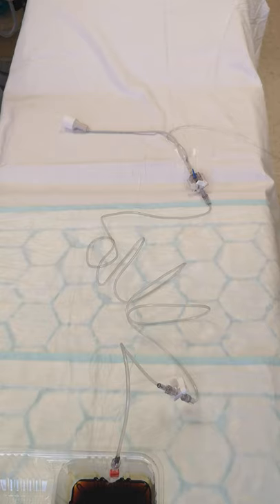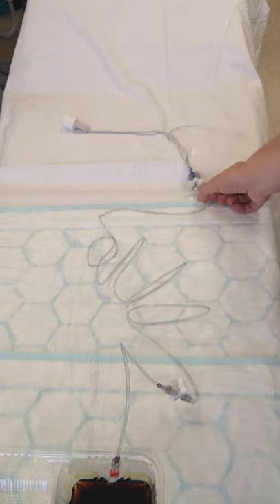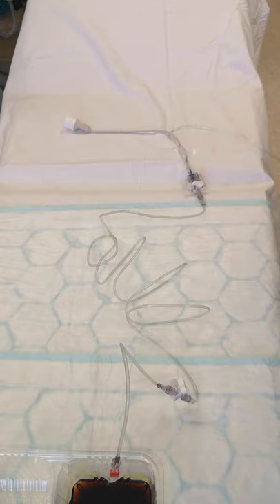The arterial line is set up, attached to the cannula, and we're getting a waveform on the monitor. The transducer has been taped at the level of the right side of the heart on the patient — typically around the upper arm area. To take a blood sample, we actually need a couple of syringes.